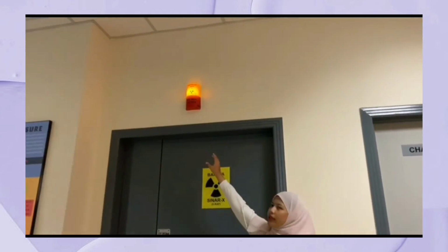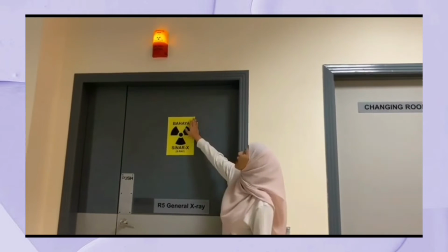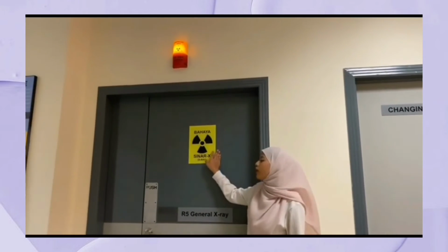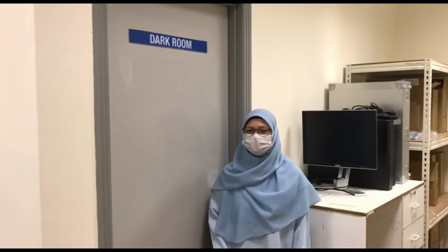Alright. Okay, when the patient is exposed to radiation, this light will turn on. These are the warning signs. They are used as a precaution for the patient and radiographer. Next, let's go into the darkroom.